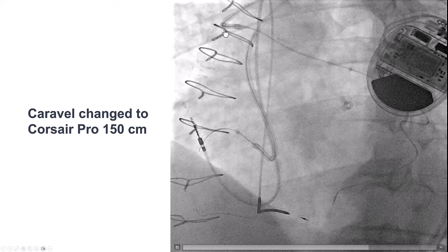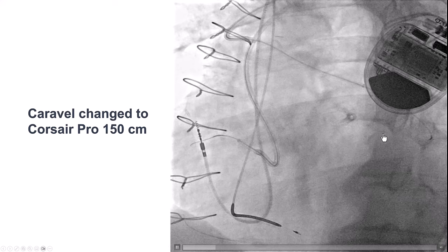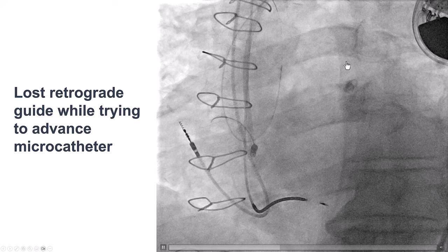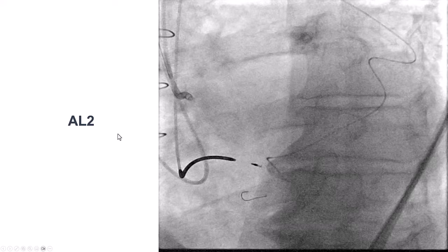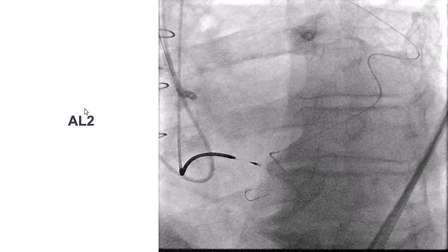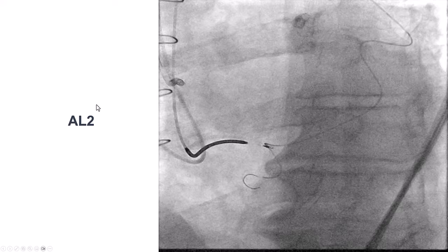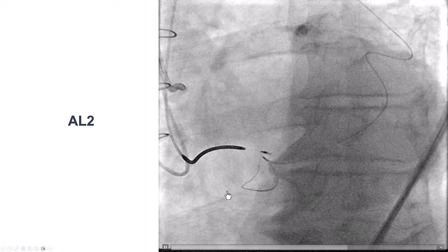We have an AL1 and a guide extension, so support is there but not absolutely optimal. When we tried to get the Corsair further up, we lost everything — the guide came out, the guide extension came out, and essentially we had to start from scratch. This time, we changed the guide to an AL2, which was probably the most important maneuver during this procedure. The AL2 provided much more support than the AL1, which was critical to navigate through this heavily calcified occlusion of the right coronary artery.